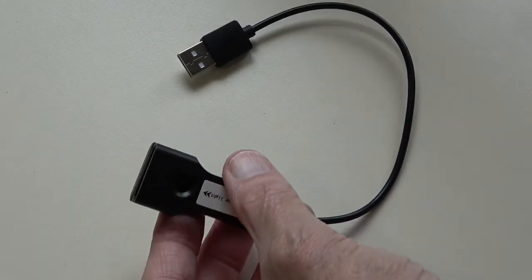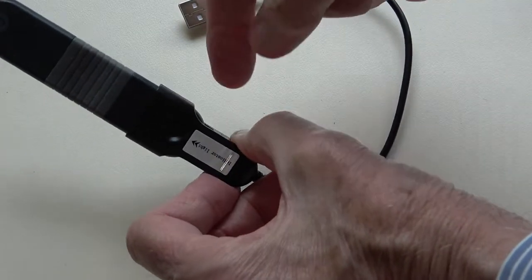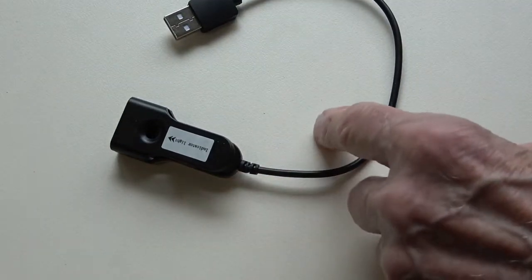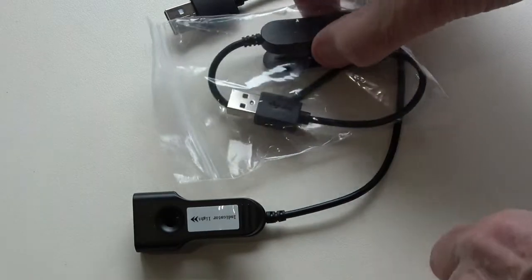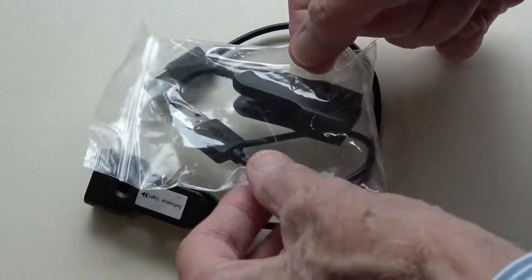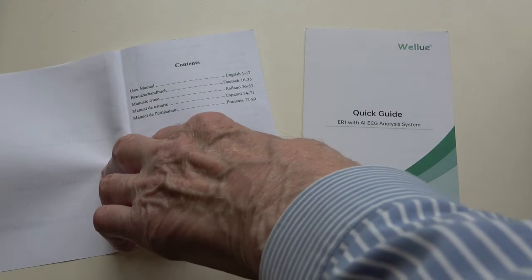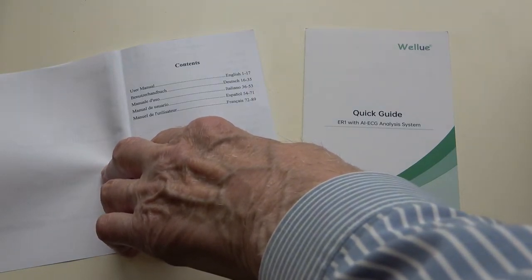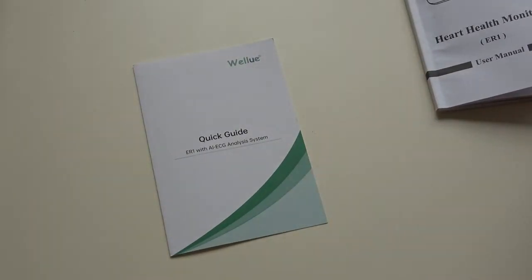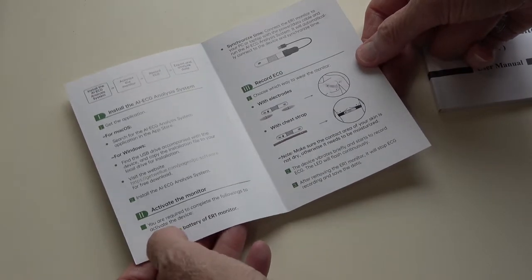You also have this USB stick which contains the program for loading onto your PC or laptop. This is a little lead that connects so you can charge the device and also connect it to your PC. And for some reason you get two of these leads — whether it's because one part wears prematurely or people break them, I'm not sure. Last but not least you have a very comprehensive manual in multiple languages — English, German, Italian, Spanish, and French — though you can start with the quick guide, which is what most people will do.